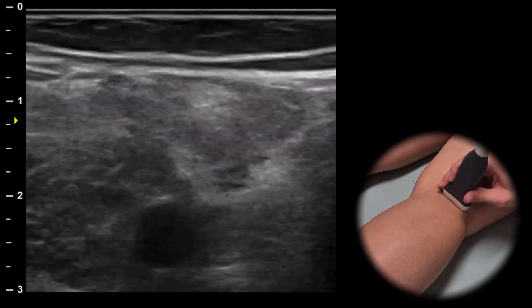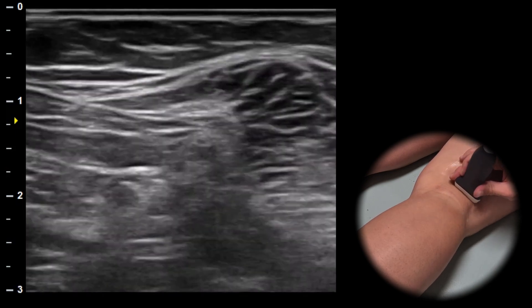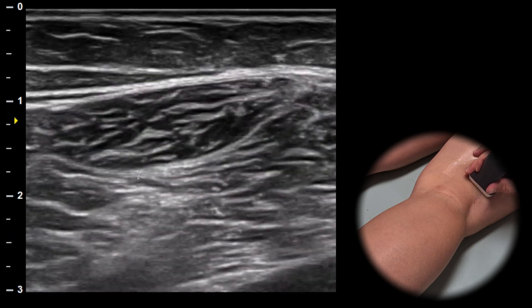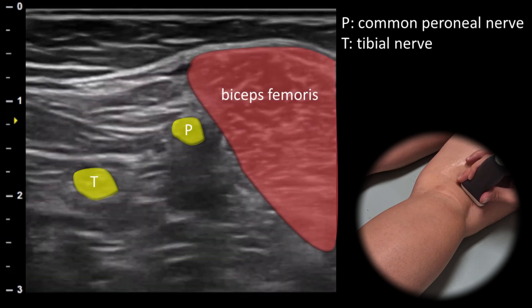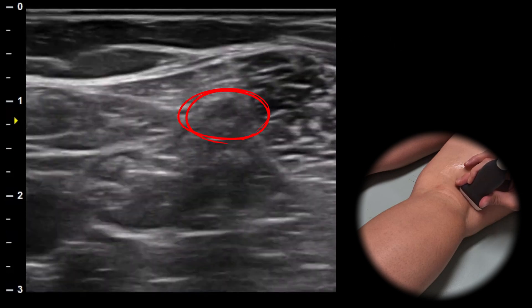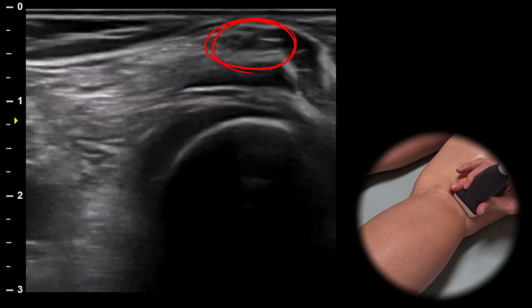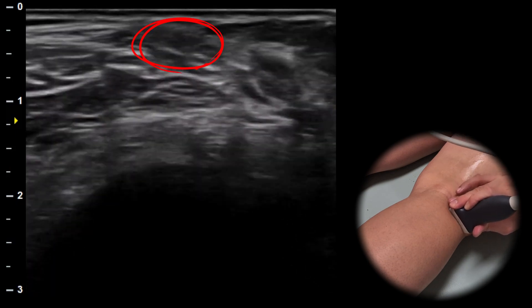Moving laterally we can locate the sciatic nerve dividing into the tibial and peroneal nerves. The peroneal nerve can then be followed distally as it runs towards the fibular head.